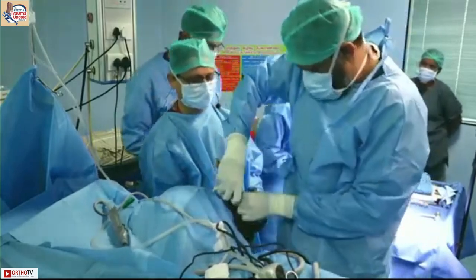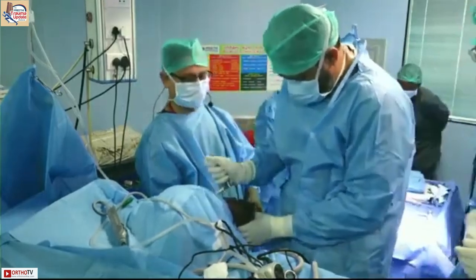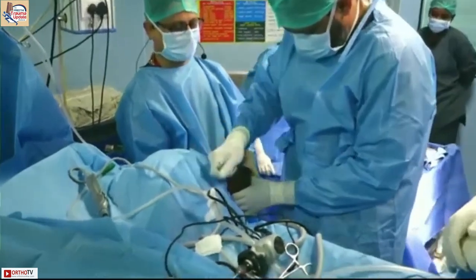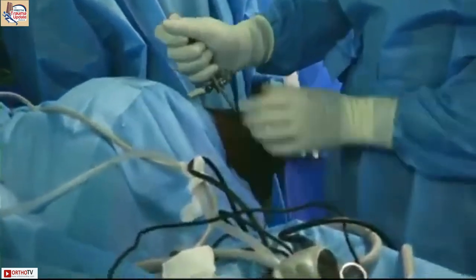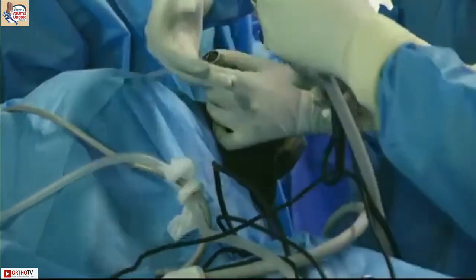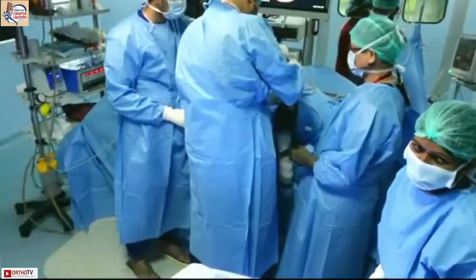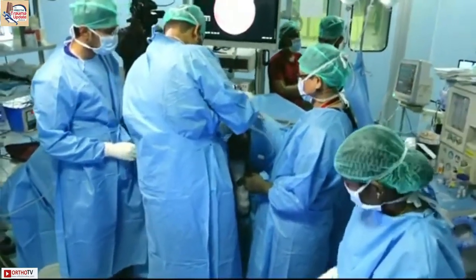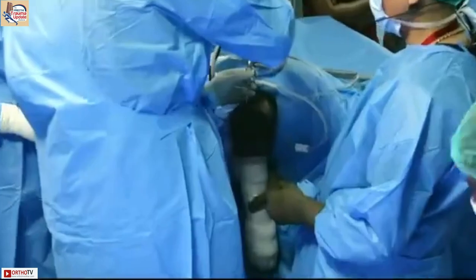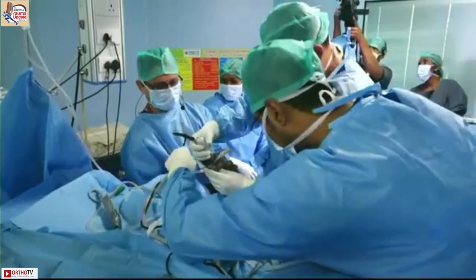That's it. So, can you see what Abhijit is doing? Yeah. It's very important to do this, because this will make sure that all the adhesions on the tip of the olecranon and all your scar tissue is gone. And it always looks a little odd, the olecranon. Okay, that's it.